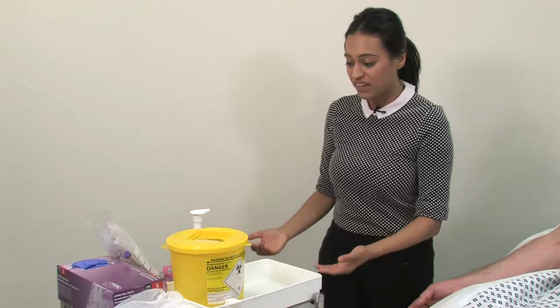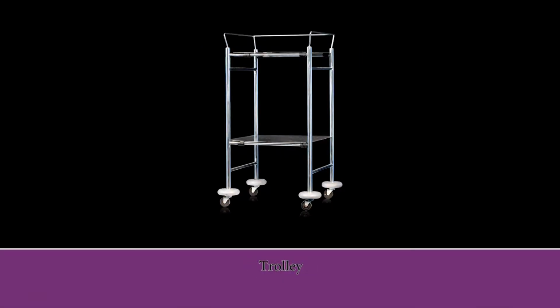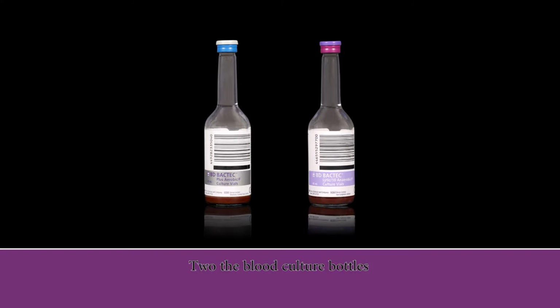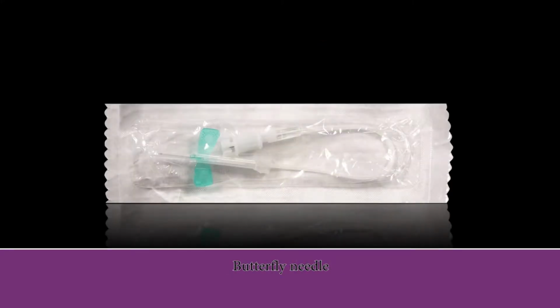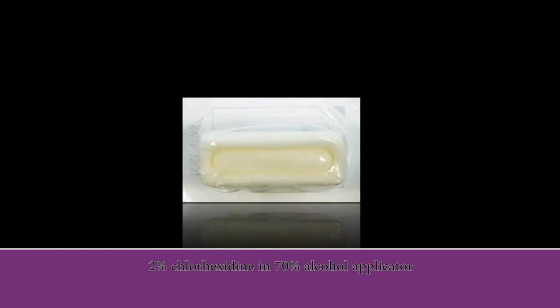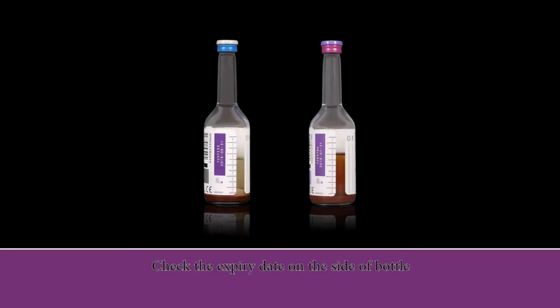Next, we can prepare our kit. You will need a sharps bin, a trolley, a tray and your blood culture kit. This consists of 2 bottles, a butterfly needle, a blood collection adapter cap, a 2% chlorhexidine alcohol applicator and a 2% chlorhexidine wipe. It's important to check the expiry date on your blood culture bottles, and this can be found on the side of the labels.